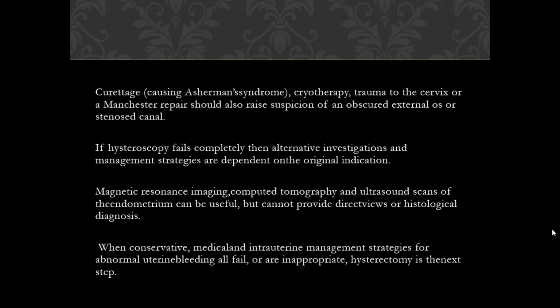For example, in the surgical forceps, the two arms of the forceps will be the positive and negative electrode. This is a very important thing in hysteroscopic surgical maneuvers, because the media used to distend the endometrial cavity should be different between monopolar and bipolar maneuvers. We have three options for distension media. All of you know CO2, normal saline, and glycine. CO2 is not used anymore nowadays.